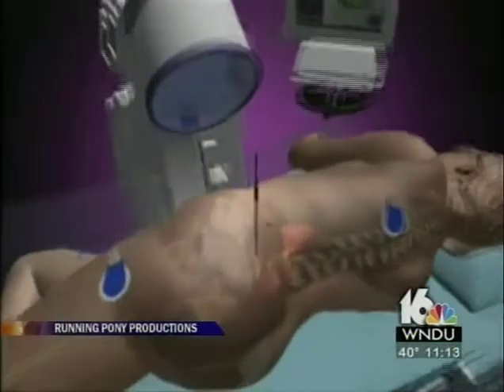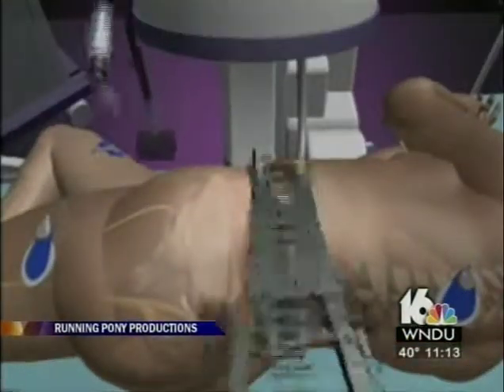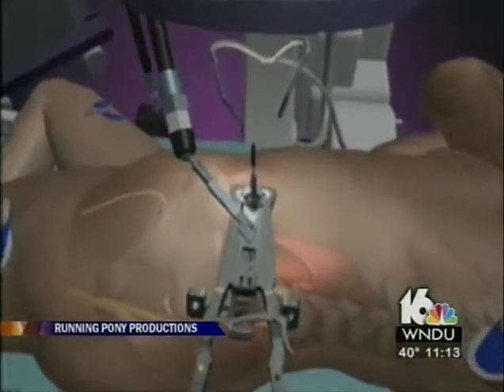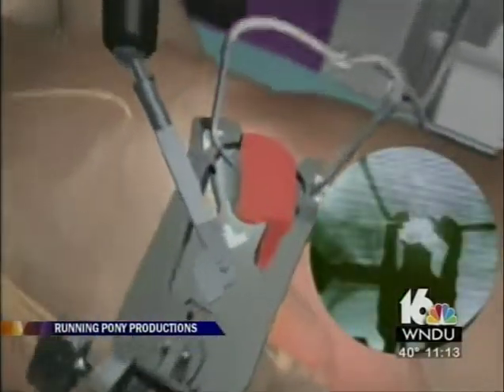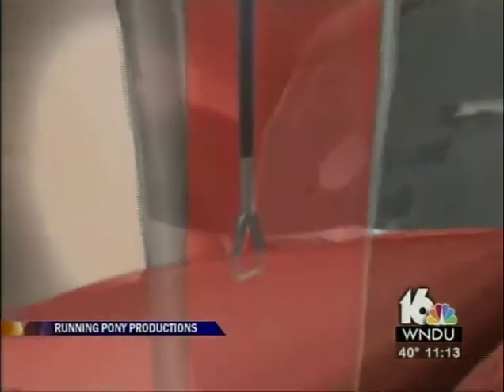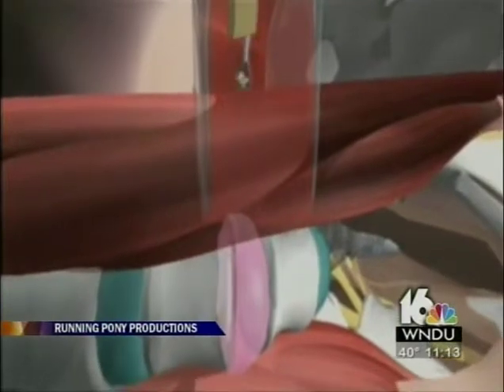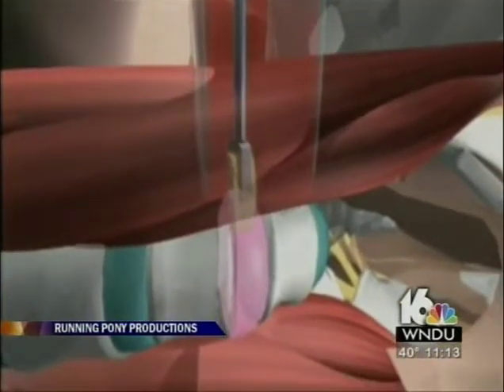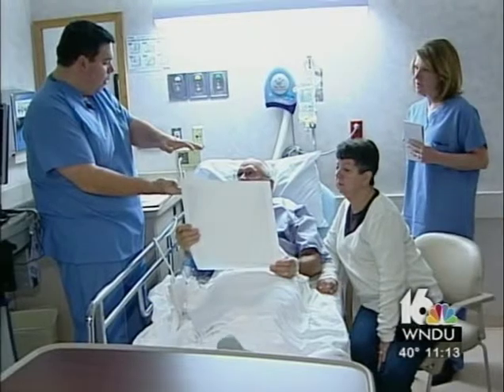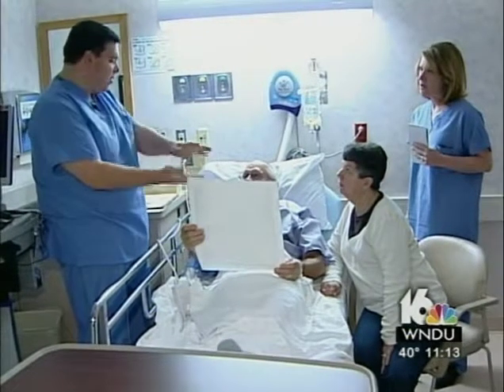Going through George's side instead of through his back or front, extreme lateral is less invasive spine surgery in spite of the name. We don't have to cut any of the muscles, we just spread them apart. And what we do in approaching from the side is we avoid the great vessels in the front. We avoid the nerves in the back, and it allows us access to the disc to put in a very large, basically a cinder block. It's pretty much a plastic cinder block, with the holes in the middle, except instead of lining the cinder block this way, we line it the other way because we want bone to grow through the middle of it. So it's kind of like a sideways cinder block.